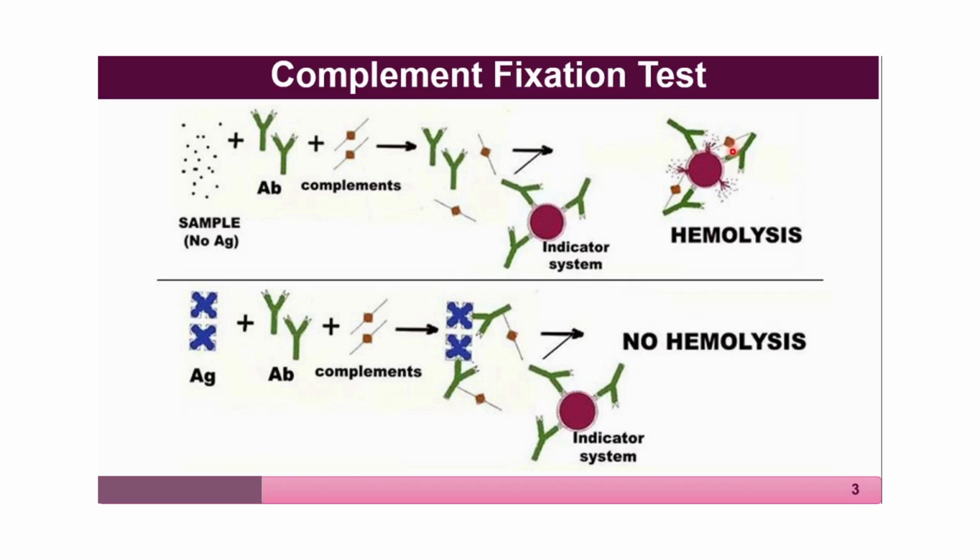The lytic reaction shown by the complement will be in such a way that the sheep RBC undergoes hemolysis and releases the hemoglobin. The entire suspension becomes red in color because of the release of the hemoglobin. Now this reaction has taken place. Why? Because the sheep RBCs were readily bound by the antibody, which is an antigen-antibody complex. The complement that you had added to the mixture was not engaged by the antibody that you had added to the serum sample to detect the antigen.